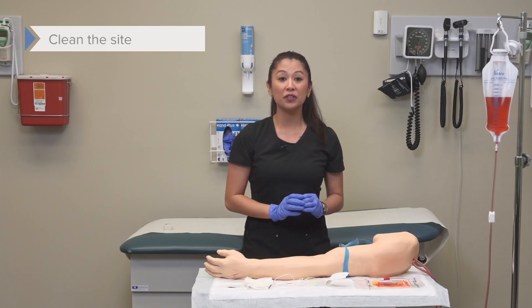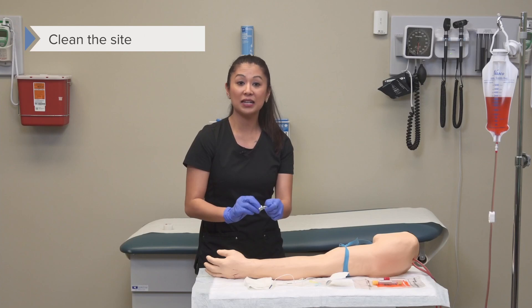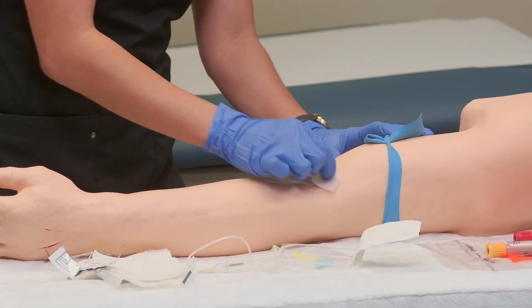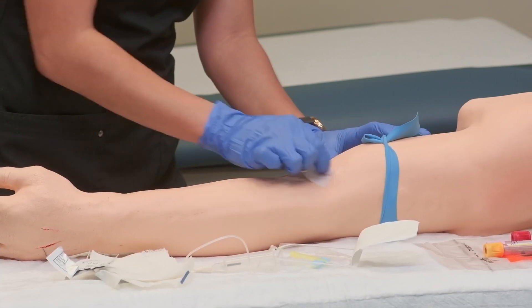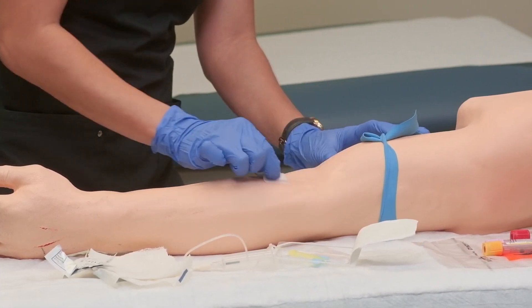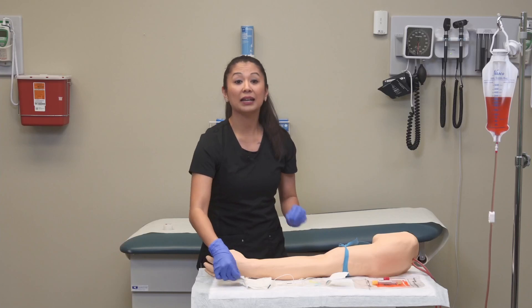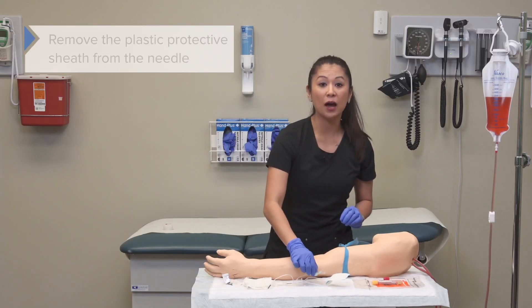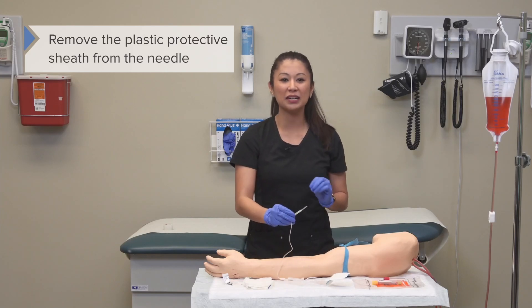Once we've got the tourniquet, I can clean my site. Take the alcohol pad and thoroughly clean the area with the alcohol swab. It's important to let this dry. Once you've done that, we can remove the plastic protective sheath from the needle.